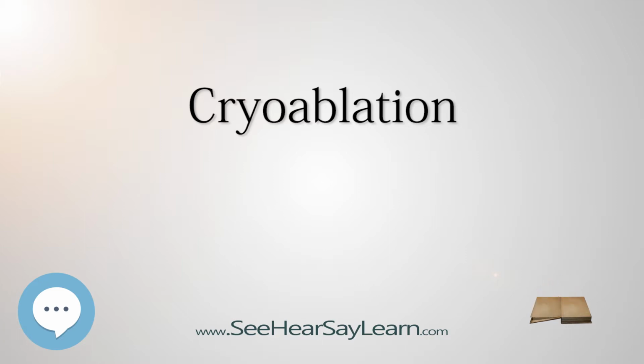Site testing. Cryotherapy is able to produce a temporary electrical block by cooling down the tissue believed to be conducting the arrhythmia. This allows the physician to make sure this is the right site before permanently disabling it. The ability to test a site in this way is referred to as site testing or cryomapping. When ablating tissue near the AV node, a special conduction center that carries electrical impulses from the atria to the ventricles, there is a risk of producing heart block, that is, normal conduction from the atria cannot be transmitted to the ventricles. Freezing tissue near the AV node is less likely to provoke irreversible heart block than ablating it with heat.